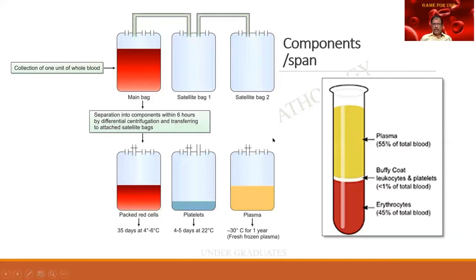So this particular one, I want you people to explain. In some colleges, the blood bag itself can be kept for viva. And this is what we get when we centrifuge the sample. The RBC settle down to the bottom, and there is plasma at the top. Plasma means it is serum plus fibrin. The Buffy coat is in the middle. Buffy coat means leukocytes and platelets.